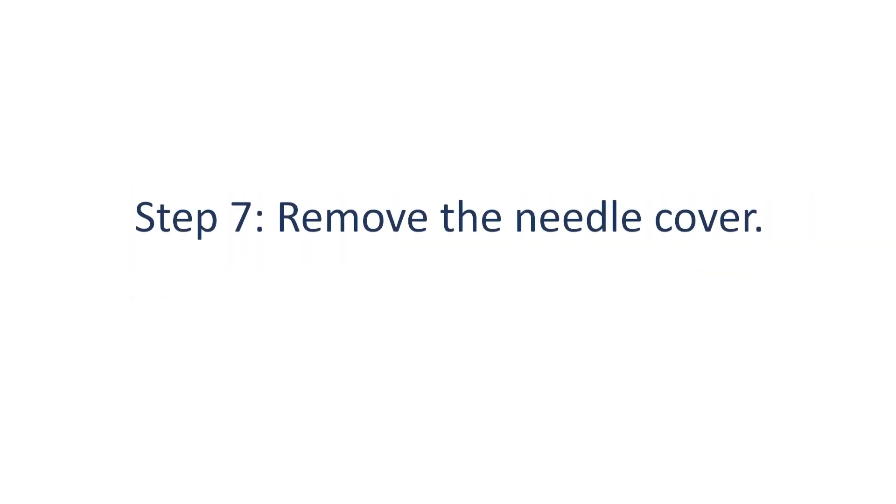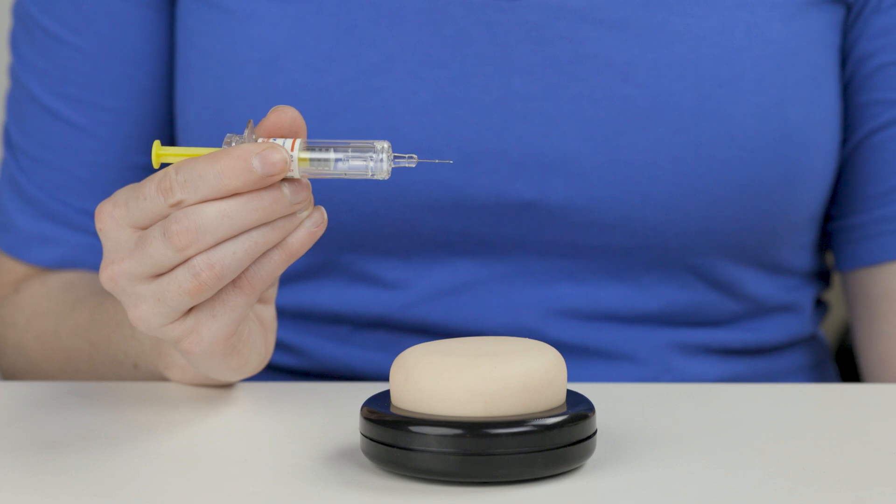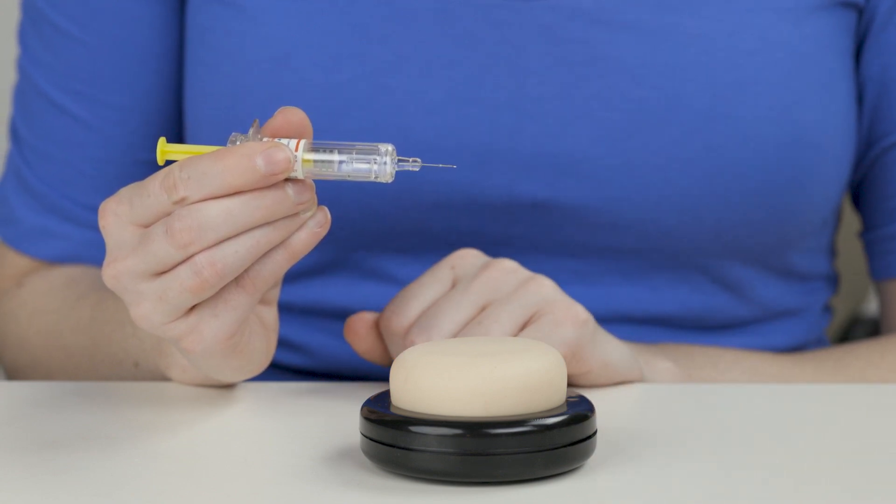Step 7: Remove the needle cover. Carefully pull the needle cover straight off. Once the needle cover is off, don't set the syringe down. Don't let anything, including your fingers, touch the needle.